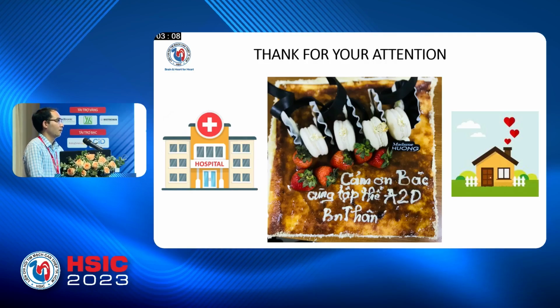Excellent presentation. And the case illustrates one point: that is the use of IABP for no reflow. I absolutely agree with this point. In my personal experience, I also found that IABP can be useful in malignant no reflow. The mechanism probably is you increase the blood pressure and then it provides stronger pushing force, because sometimes no reflow is not just the problem of microvascular dysfunction, it's also the problem of systemic pressure. If the systemic pressure is too low, probably the MCS can help.